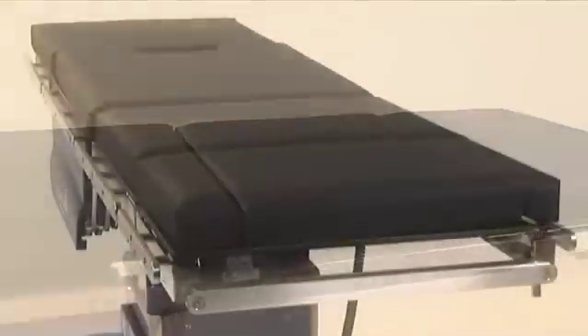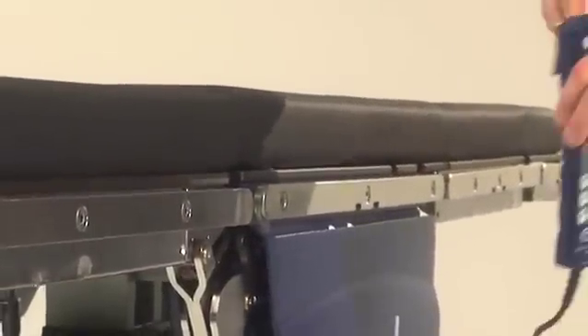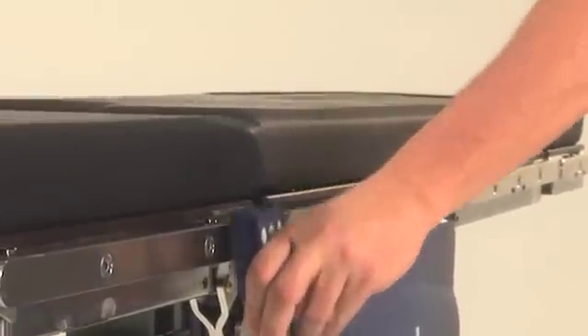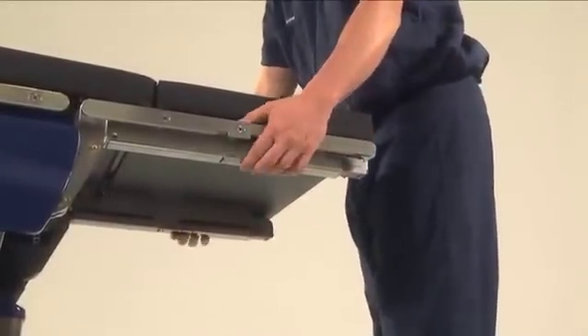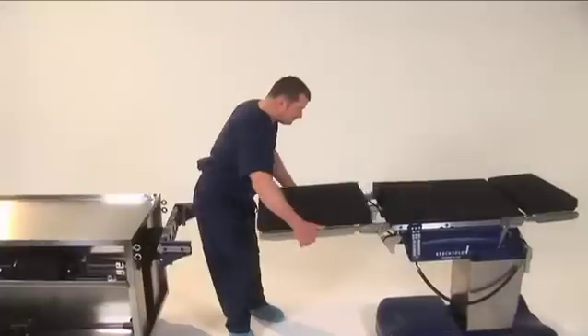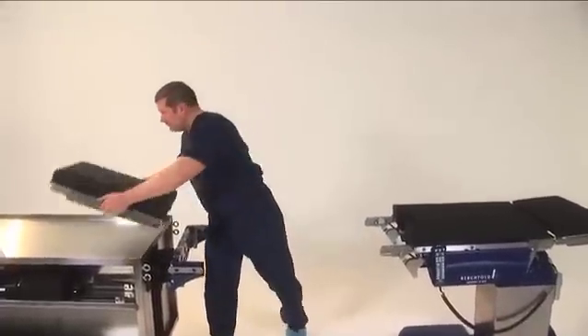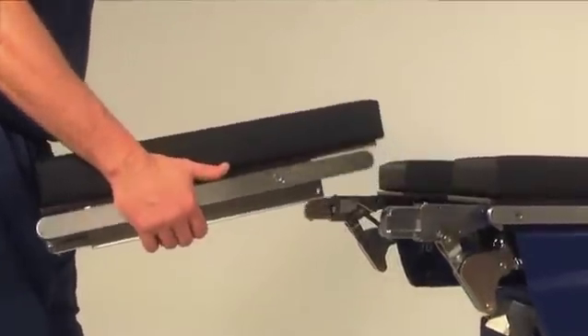A side rail runs across the head section for easy access to the hand pendant or for clamps. To remove the back section, grasp the center of the section and press the lock release buttons, then pull the section away from the table. The leg section is removed in the same way. Be careful to balance the weight of the leg section so it doesn't tip downward when pulled from the rail system.